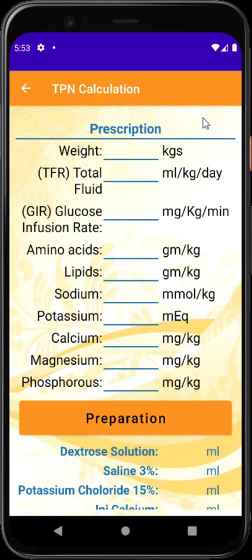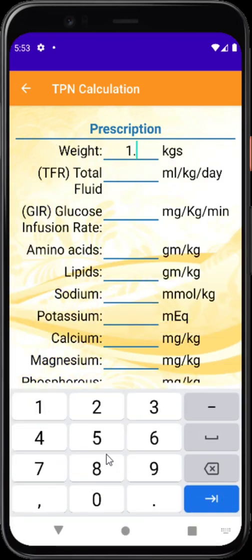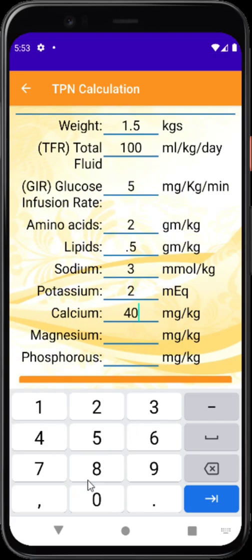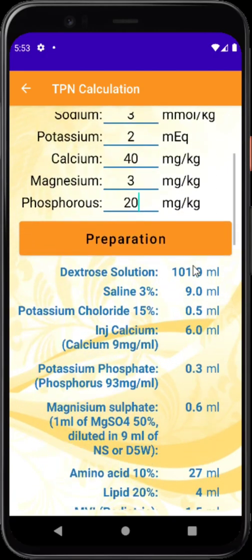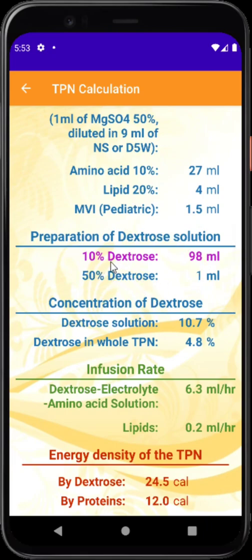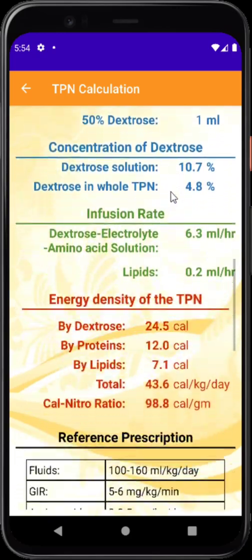In the TPN calculator, type the weight — say 1.5 kilos — and enter: total fluid 100 ml/kg/day, glucose infusion rate 5, amino acids 2, lipid 0.5, sodium 3, potassium 2, calcium 40, magnesium 3, phosphorus 20. Press calculate and you get the complete preparation recipe. It gives the amount of dextrose to mix — in this case 98 ml of 10% dextrose and 1 ml of 50% dextrose — and displays the dextrose concentration and energy density of the fluid.